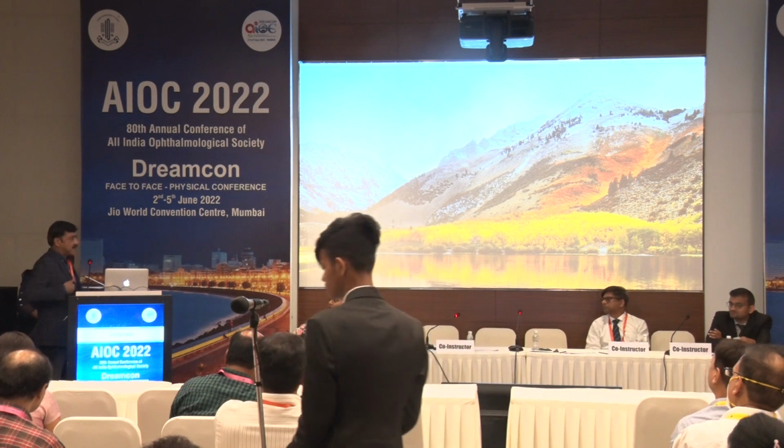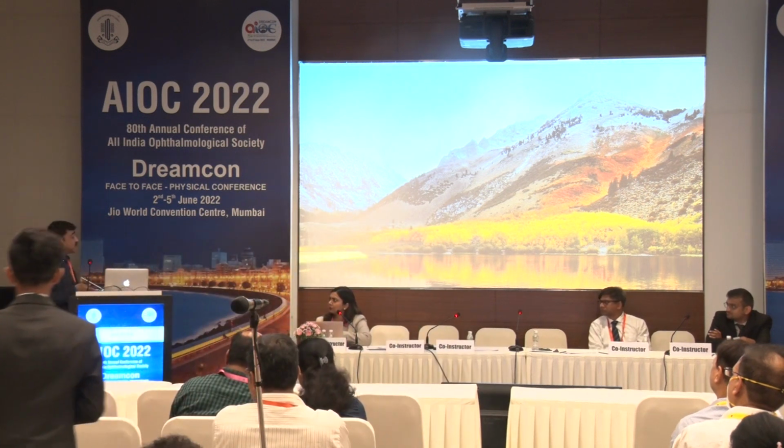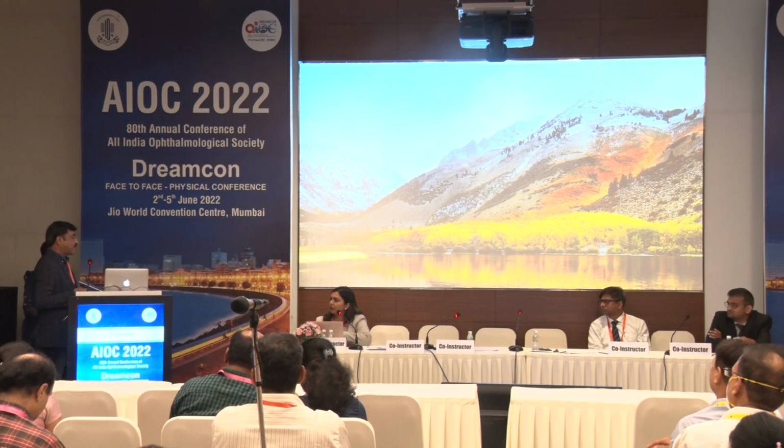I would have had problems earlier when I did it for a 1.7 or 2 diopter patient with the anterior opening; the patient did have complaints of dry eye and a lot of foreign body sensation. So for the last year or so I have stopped the anterior opening, I just keep it intrastromal, and it absolutely works up to 1 diopter. 1 to 1.5 it's working, I have followed that more recently, but for the last 5 years I've been having absolute results.